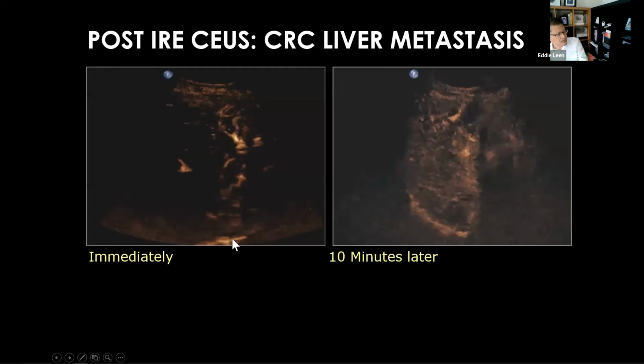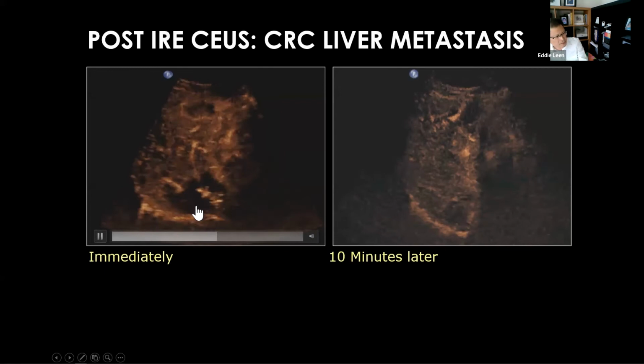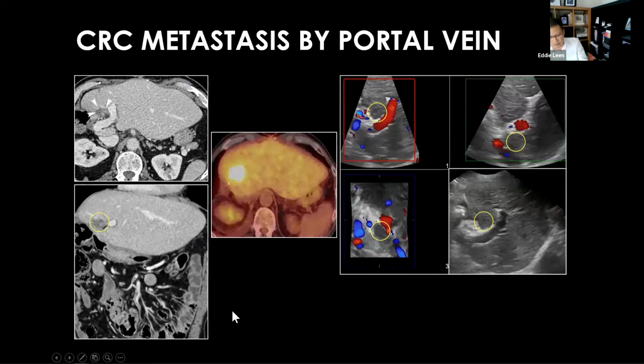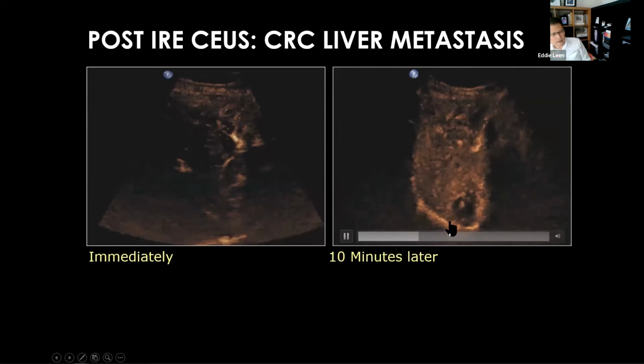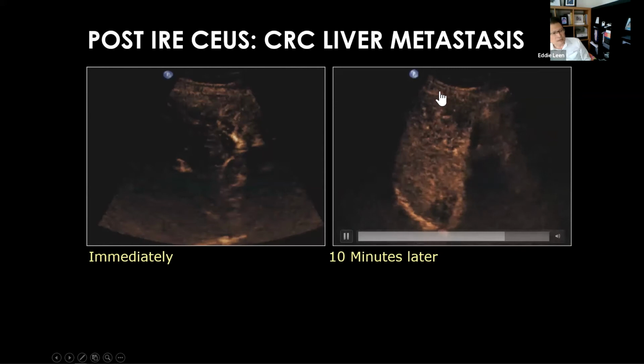Now, immediately after the IRE ablation, you can see the margin is still as well defined compared to the RFA or microwave, and you can still see the integrity of the central vessels initially, but you can see devascularization of the ablation zone there. Ten minutes later, we already have involution and still see the needle track, and we don't see any vascularity now. This scan was done really while we were ablating the most superficial lesion.